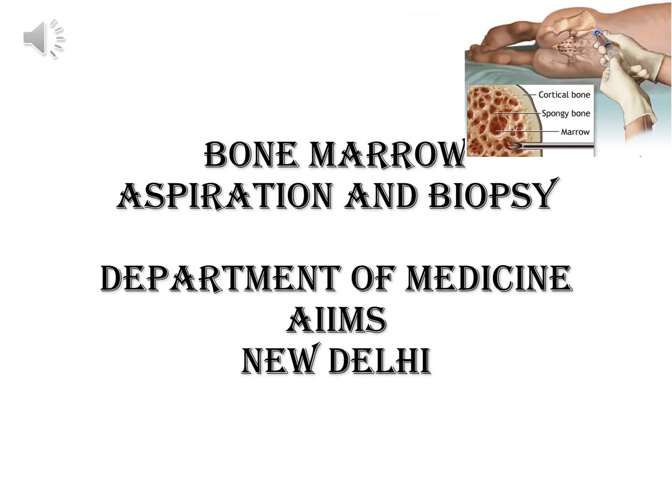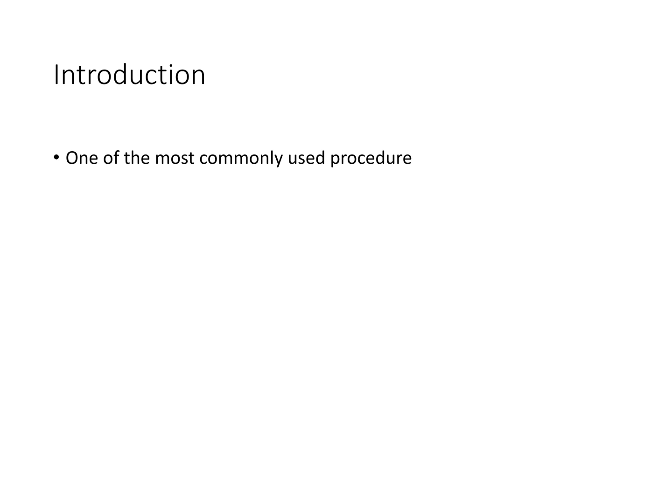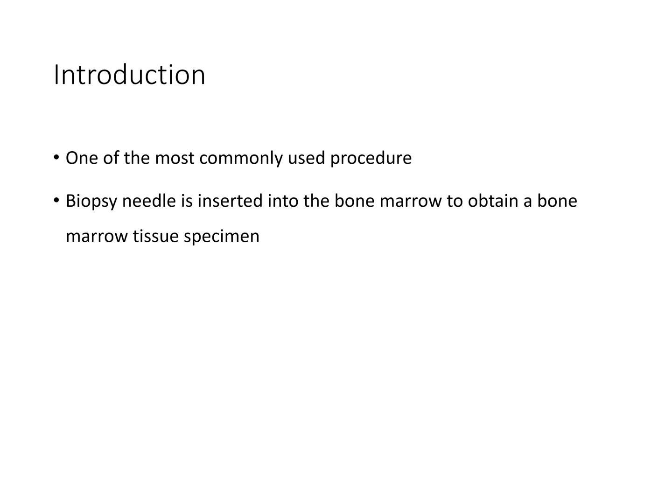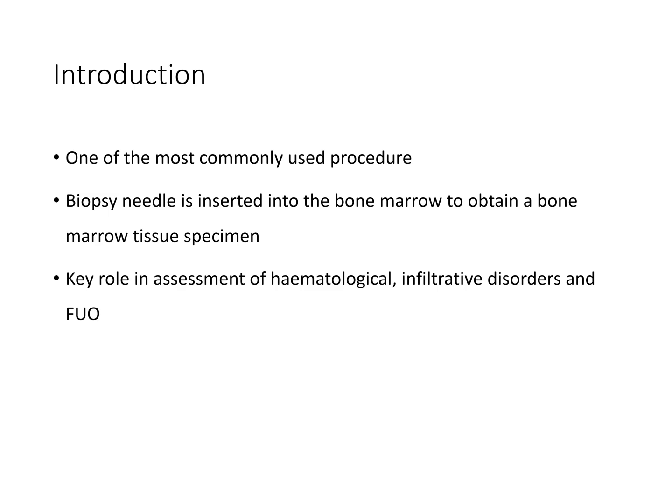In this video, we are demonstrating the procedure of bone marrow aspiration and biopsy. Bone marrow biopsy is a common procedure done in our wards. The resident uses a bone marrow biopsy needle to obtain aspirate and tissue from the bone marrow. It is used to diagnose a variety of diseases and conditions which involve bone marrow and blood cells.